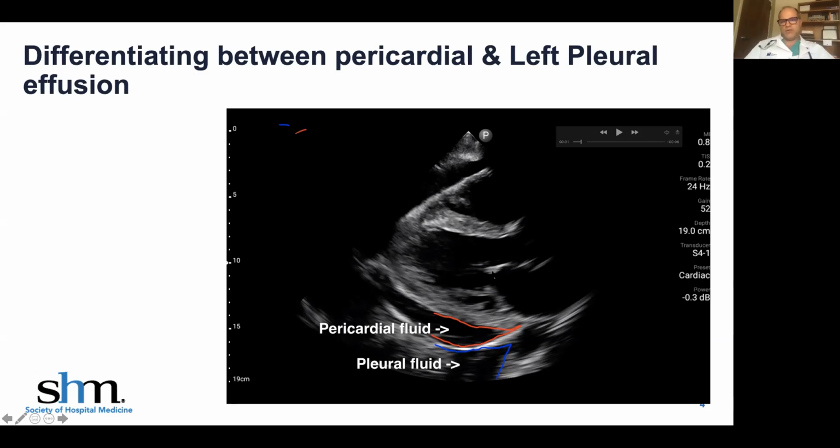Patient also had a low ejection fraction and had uremia as the cause of the findings, as well as systolic heart failure.